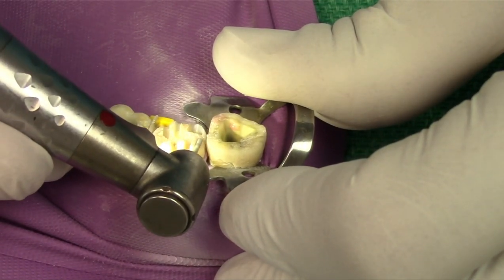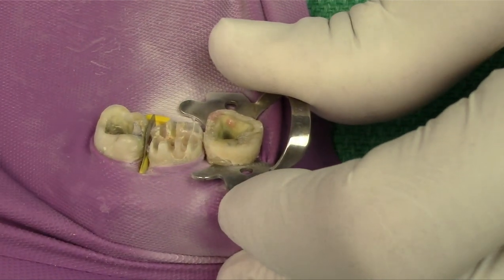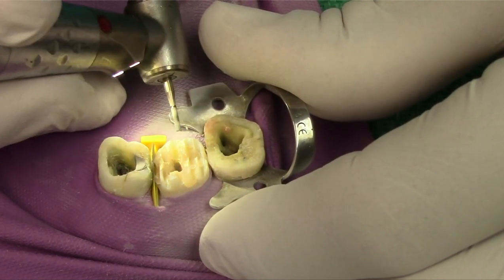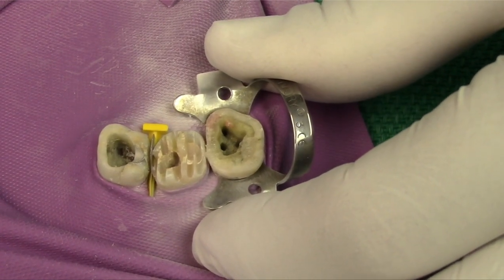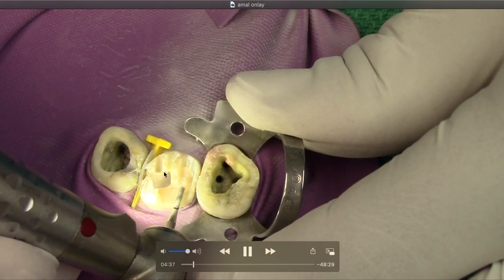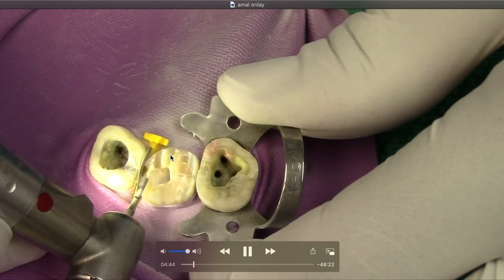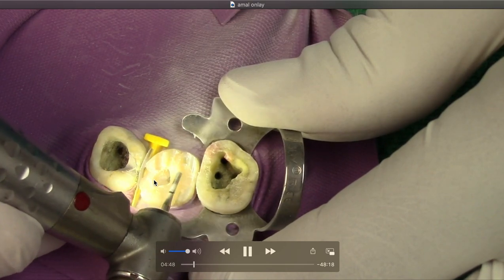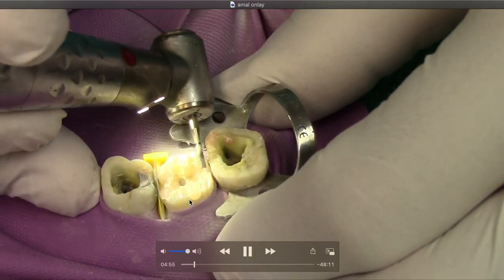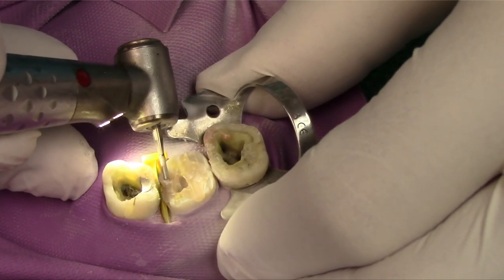We'll keep refining our depth cuts. In amalgam, we want two millimeters if not deeper. I know it seems like a lot of tooth structure removal, but this preparation is actually less invasive than a crown preparation. We're only removing the occlusal two millimeters versus reducing 0.5 to one millimeter around the cervical part. After a root canal, you've already bored out the orifice, thinning the pericervical dentin with a crown prep. So ironically, this is more conservative in terms of mechanical strength of the tooth.